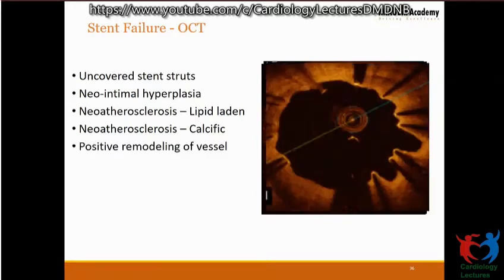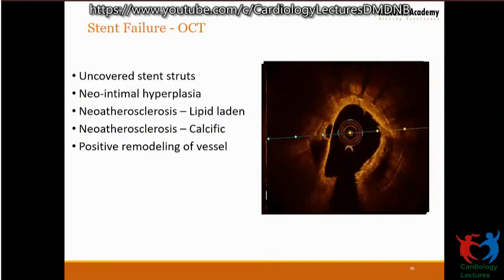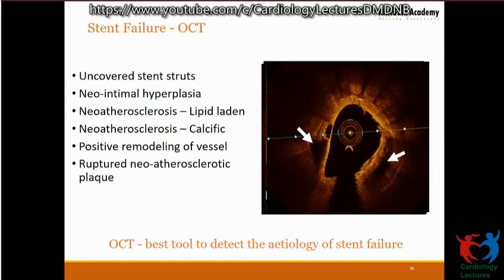And so this is called positive remodeling causing evagination of the struts. So the vessel has grown outward, leaving these struts there. So you can see the endothelium touching these patches. And the basic problem of neoatherosclerosis is the rupture of a plaque. You have two plaques which have ruptured, and this has caused an ACS in a neoatherosclerotic segment.